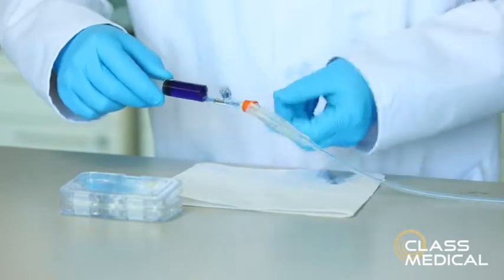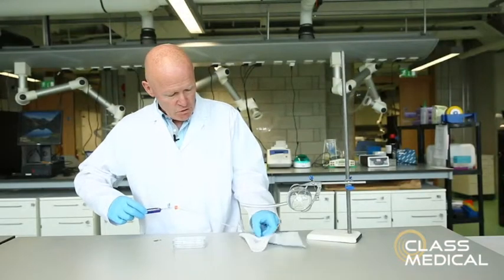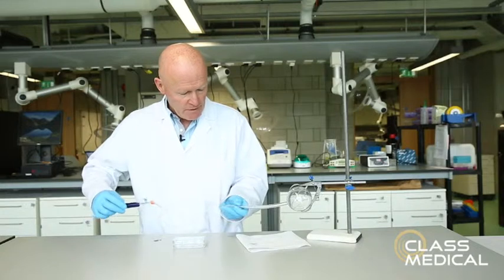Connect to the inflation port of the catheter and the user places the catheter into the urethra.